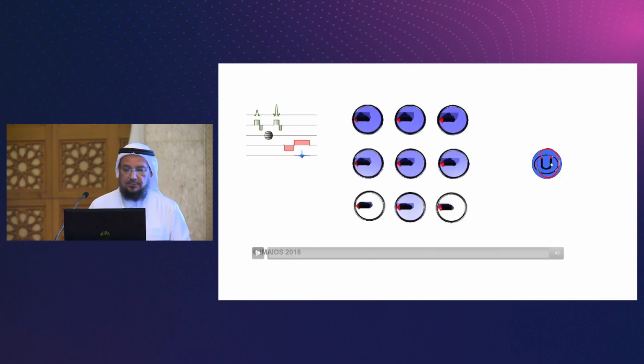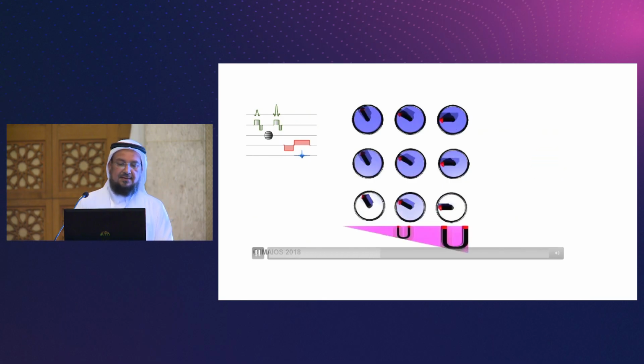So imagine that we already put the patient inside. Now all the protons will precess at the same frequency of the magnet, which we call the Larmor frequency. If this is 1 Tesla, they will start at 42 megahertz. What happens if I now start a gradient magnetic field?